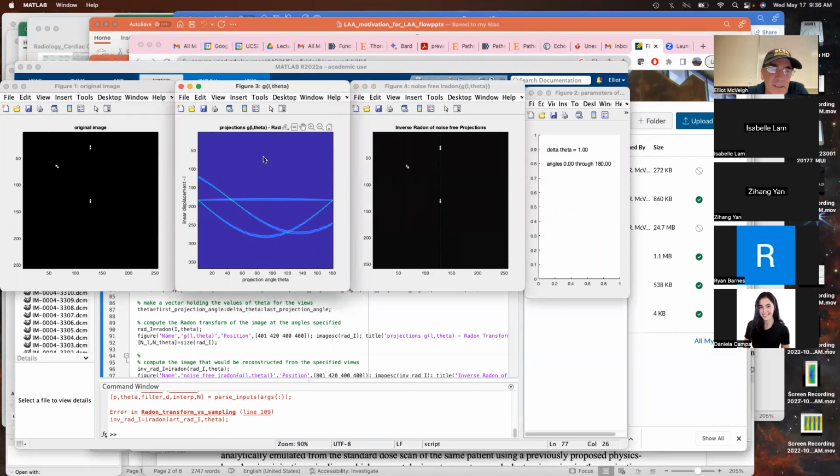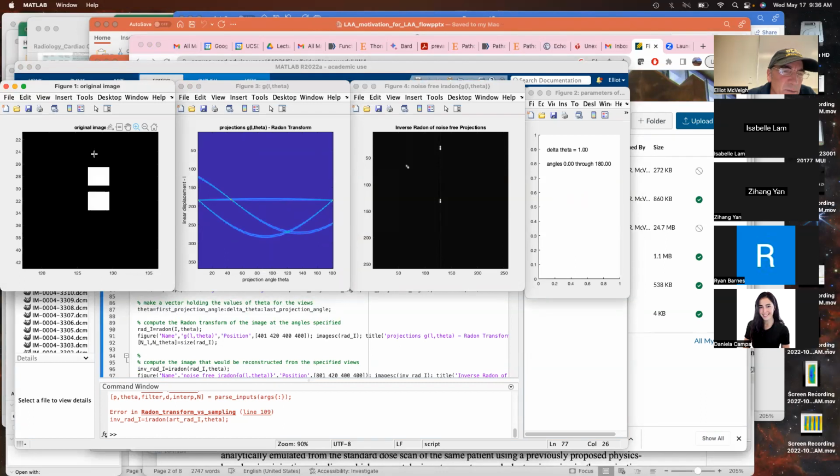Original image. This is the g of l and theta from that picture. And then we subsample this and create a new image here. We can zoom in with this little box and look at the detail here. So it's 26 to 30. This is a 4, is that 4? Yeah, 4 by 4 pixels here. And it looks like there's a gap of maybe 1 pixel right there, and then 4 by 4 again. That's the thing right at the top there.